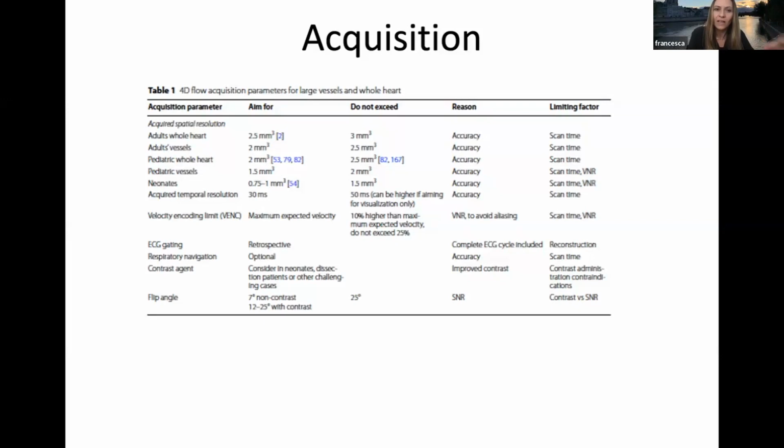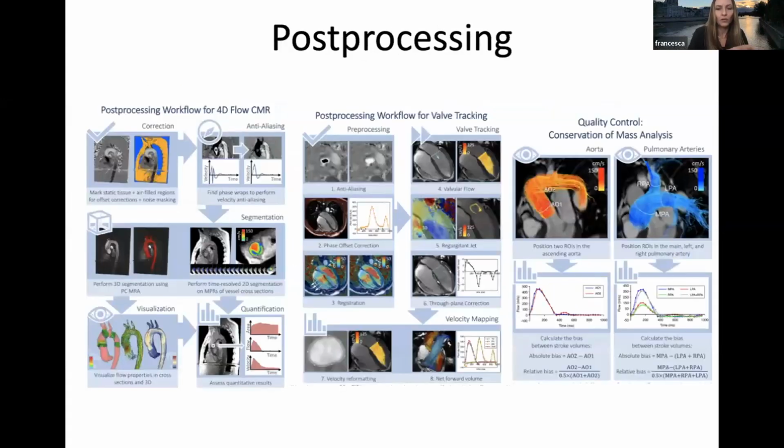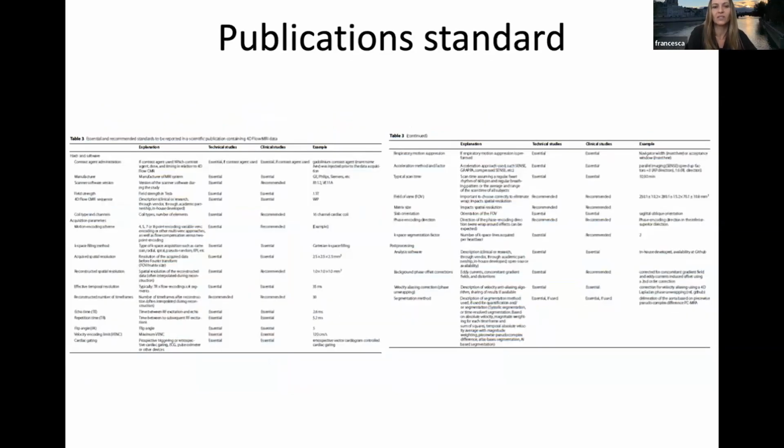Once you have a good setup with your engineer, this sequence is really stable. And parameters don't change a lot between patients in pediatric age. So it's really simple also for your technician to acquire it, and it's really feasible in clinical life. We also try to help you understand how to post-process the sequence, which of course needs a learning curve. But now technology is advanced enough to give stable and reproducible results. So we really want to support the diffusion of this kind of technique.